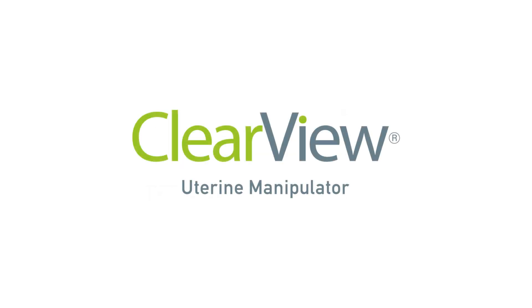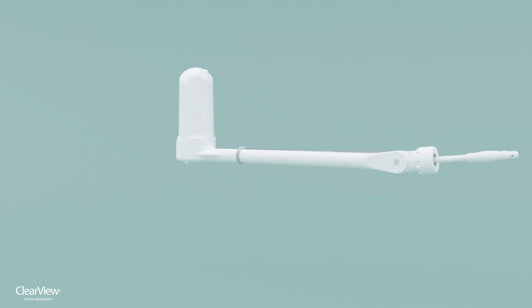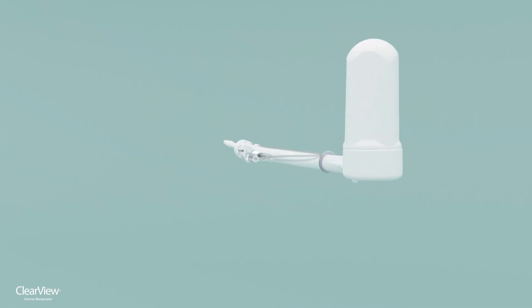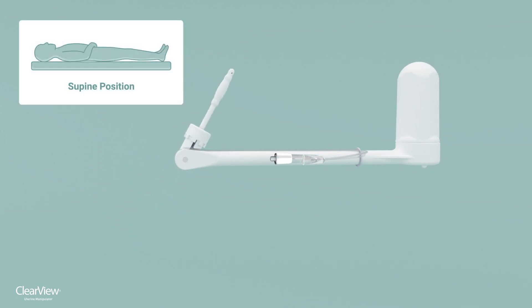The ClearView uterine manipulator provides optimal visualization and complete uterine control during laparoscopic procedures. ClearView pivots at the cervical os, which increases mobility and provides greater visibility to the surgeon. The design also allows the patient to remain in the preferred supine position.